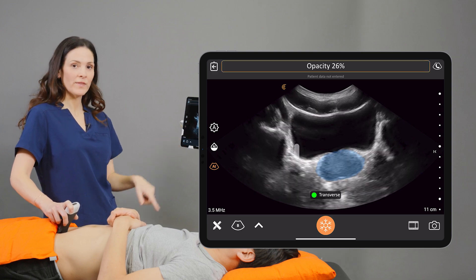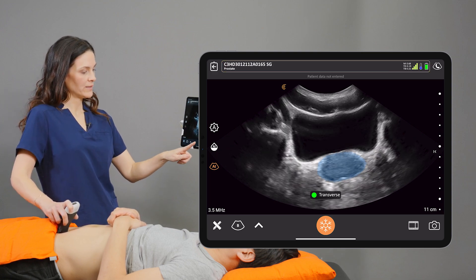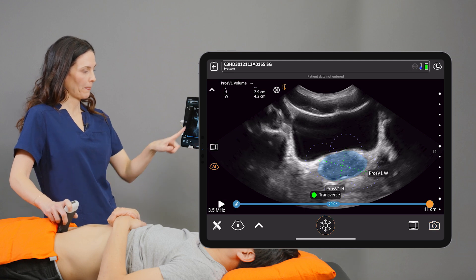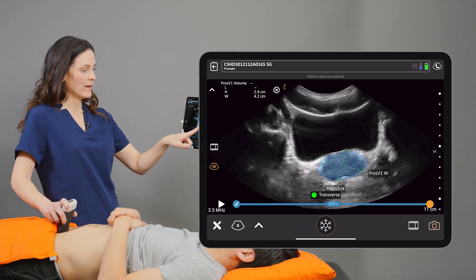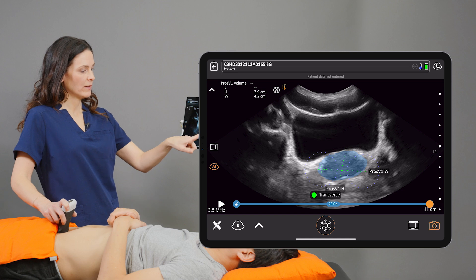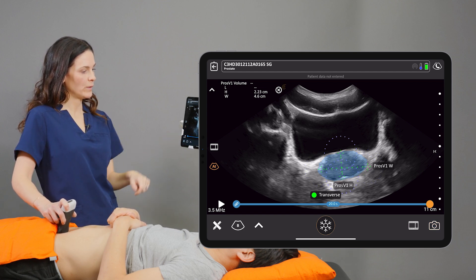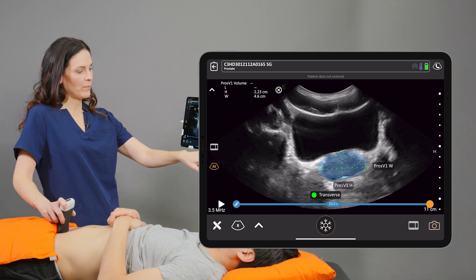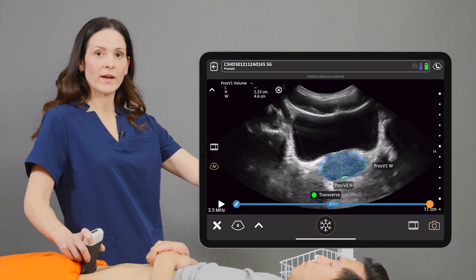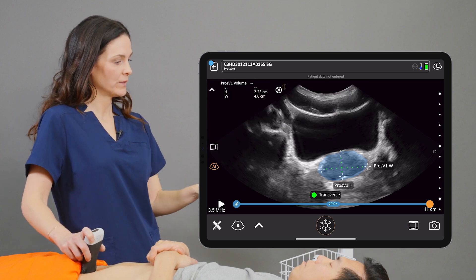When I'm happy with the look of my image, I'll select the Freeze button and the calipers that have been placed for me. I can adjust the caliper placement by dragging my finger over the crosshairs and placing them into a position that I like. I'll tap the camera icon on the bottom right hand side of the screen to save my measurements and image.